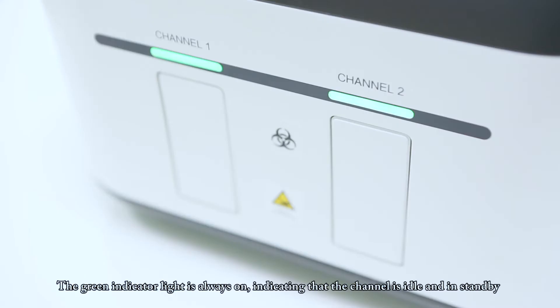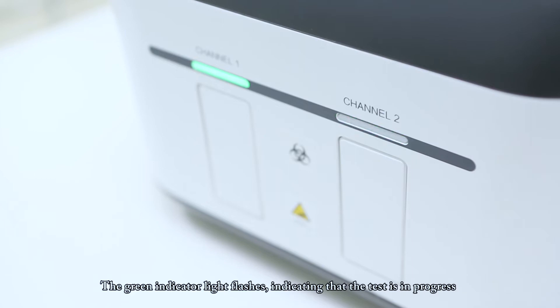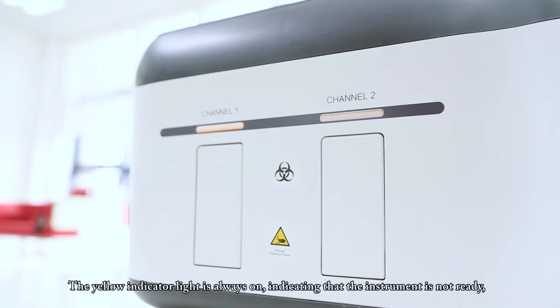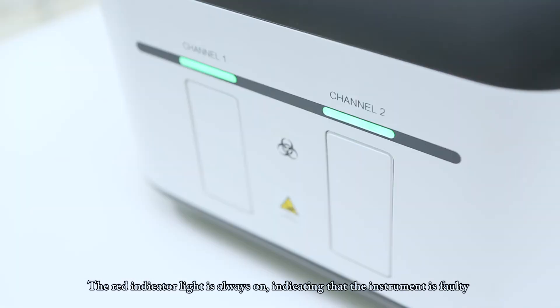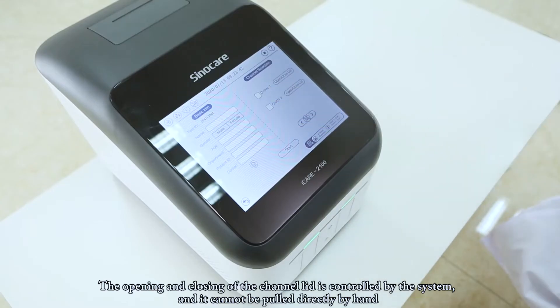The green indicator light always on indicates the channel is idle or in standby. The green indicator light flashing indicates a test is in progress. The yellow indicator light always on indicates the instrument is not ready — for example, the test temperature has not reached the required level. The red indicator light always on indicates the instrument is faulty. The opening and closing of the channel lid is controlled by the system and cannot be pulled directly by hand.